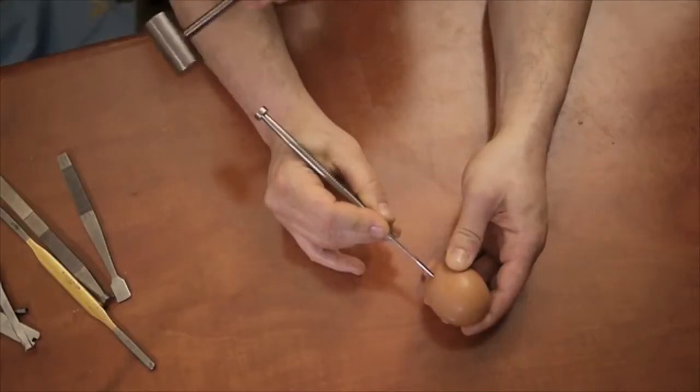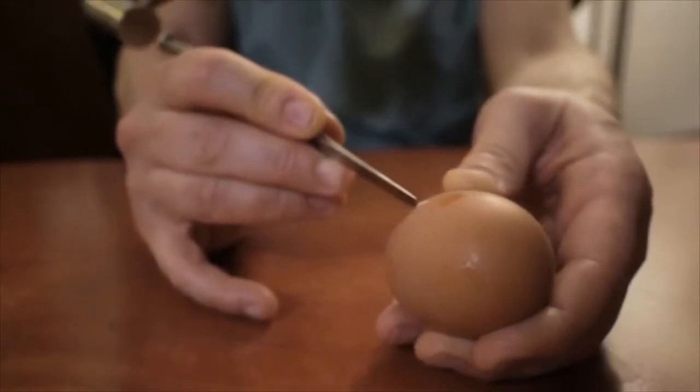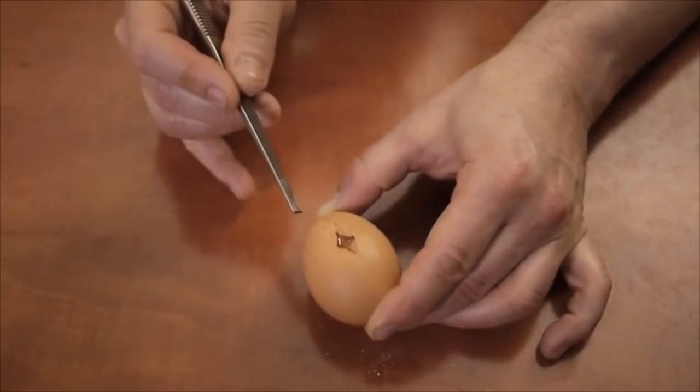I've been working on the development of ultrasonic rhinoplasty for 3 years after having realized that we were lacking control on bones reshaping in rhinoplasty, whereas cartilage could be accurately reshaped since the advent of cartilaginous sutures and grafts. We must also consider that the instruments we are using for rhinoplasty were designed more than a century ago, and that they may be too aggressive for the delicate nasal bones. Finally, whatever the approach, closed or open, bone surgery of the nose has until now been done blindly.